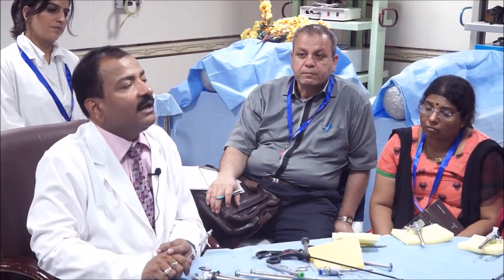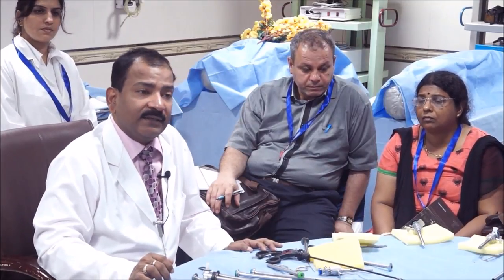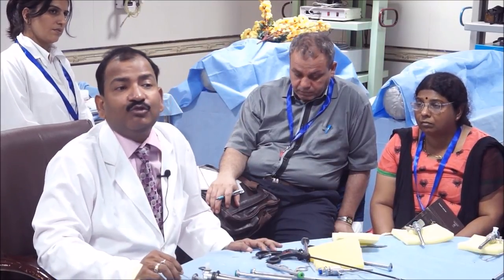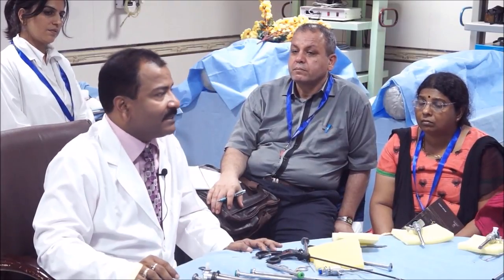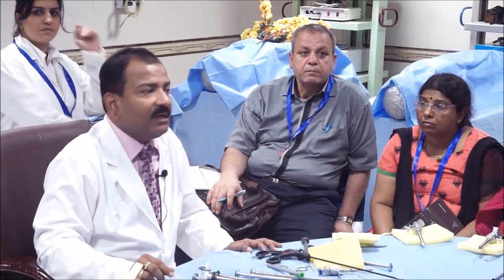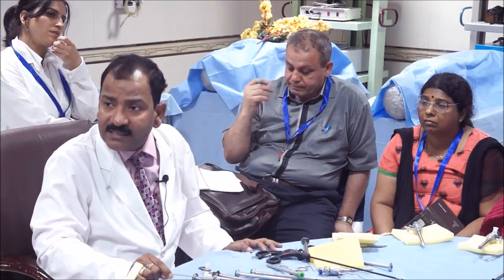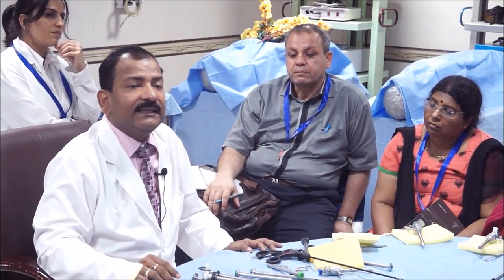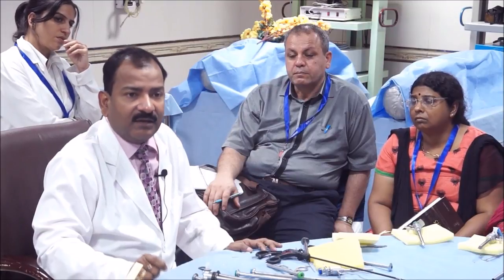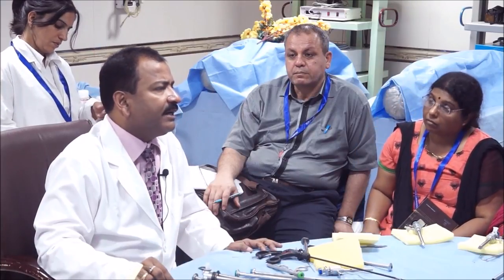That's the reason Americans, and even in a developing country, whenever you have a doubt, you should use an endobag. You should use an endobag because even a normal-looking gallbladder has a chance of carcinoma, and that can lead to port-site metastasis. And you know, port-site metastasis is medico-legal negligence. If you have port-site metastasis, our patient can sue us, because it is already published that it is due to not using the endobag. Not only that, sometimes if you do dermoid cyst surgery and have not used a good quality endobag, there is a chance of squamous cell carcinoma of the port wound due to the dermoid cyst. Because if those contents of the dermoid touch the abdominal wall, it can create a problem. So these are some of the complications which we must keep in mind and avoid.